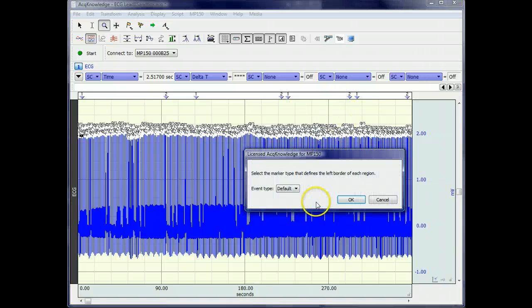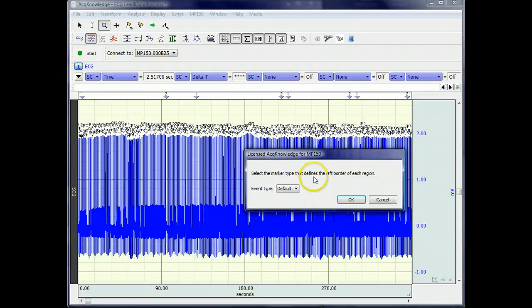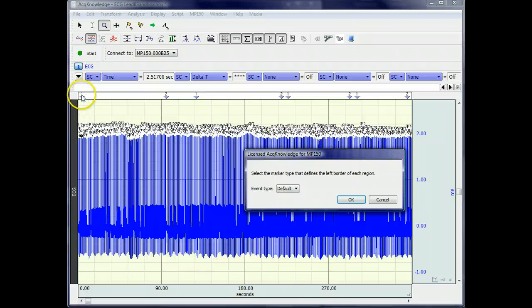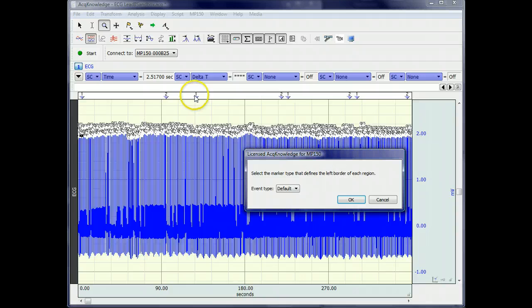If I choose event marks, the script is going to ask me what event marks are used to define my borders. What I'm going to do here is say that I want to analyze heart rate variability between this event and this event, and then ignore this section, then compute it again between this event and this event, and so on.